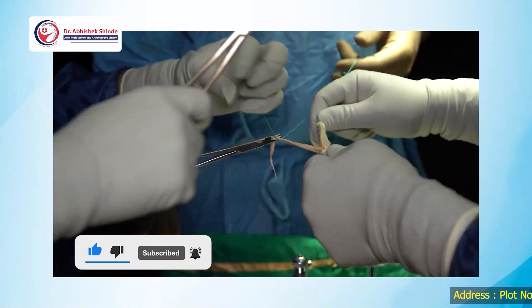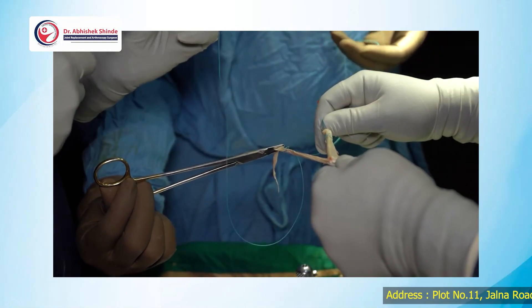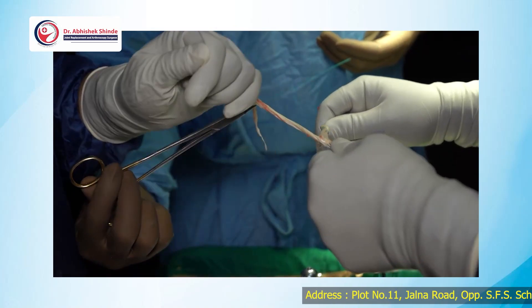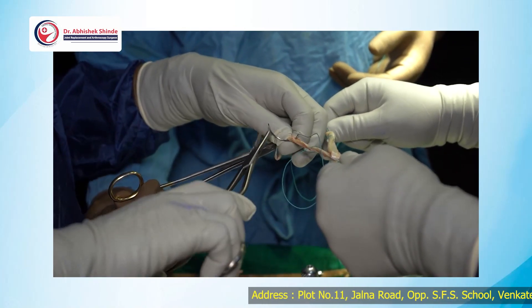I prefer to use Ethibon 2. Ethibon 5 I feel is very bulky and it takes a lot of time to dissolve as well. That's why I prefer to use Ethibon 2 rather than Ethibon 5.